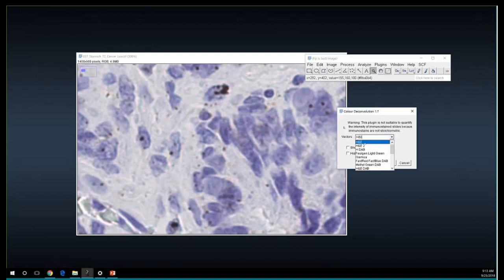Remember, we're only interested in the hematoxylin, not other colors, so even if you choose H&E, one of the results should be almost the correct hematoxylin. However, sometimes this won't work because, as I mentioned, these are presets. That's why I'm going to show you the more general approach and how you actually get the image of the color that you want exactly.